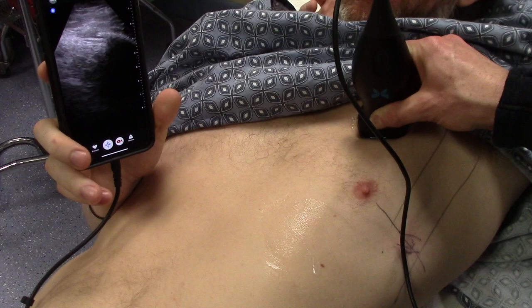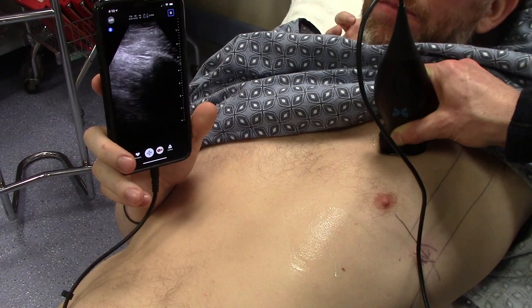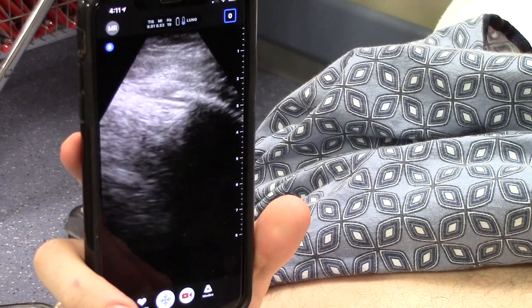You can actually see the lung moving quite a bit with his heart rate too, which is what gives you kind of that pulsating shine there. But right there, you see a really nice definition of sliding into the lung. Just a little more breathing in and out, Daryl, a little bit bigger. There's a nice, good slide.